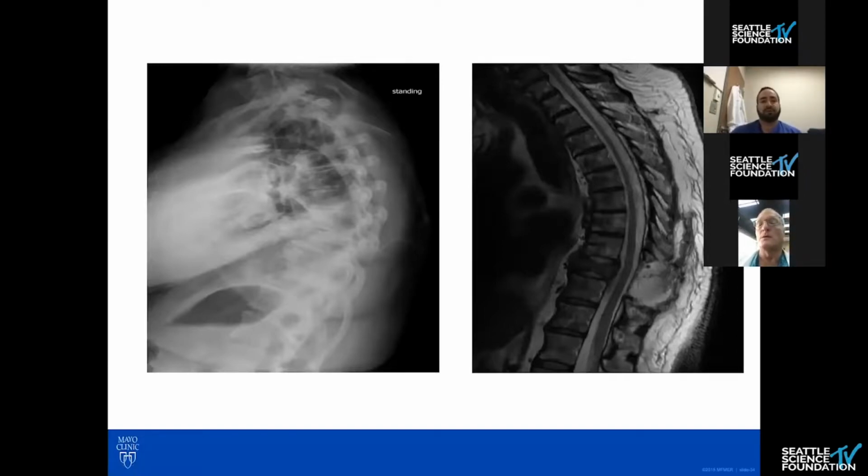So as a trial run, we went relatively short considering the lack of mechanical pain. She is over 1 year out and doing very well. But with her, we also learned that you want to use 1.5 Tesla MR. You do not want to use a 3 Tesla MR because even a little bit of titanium within the shell can make it actually quite difficult to visualize these on MRI.